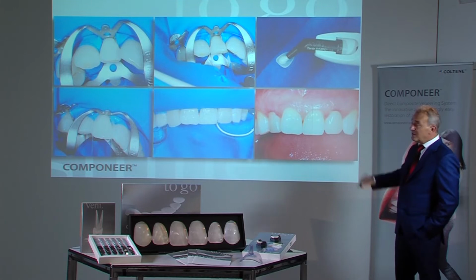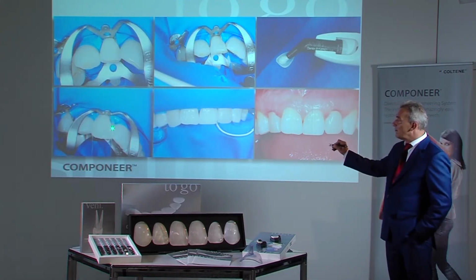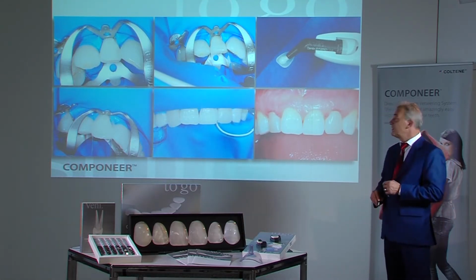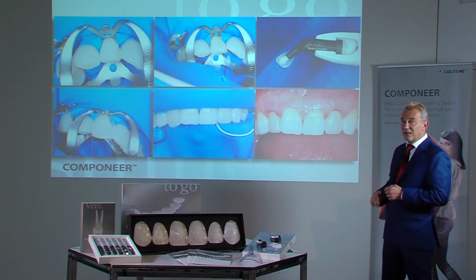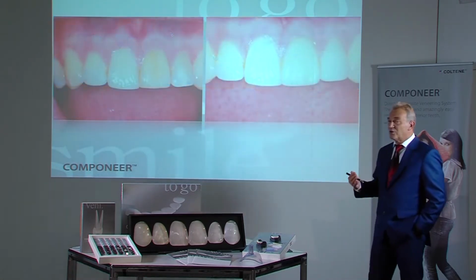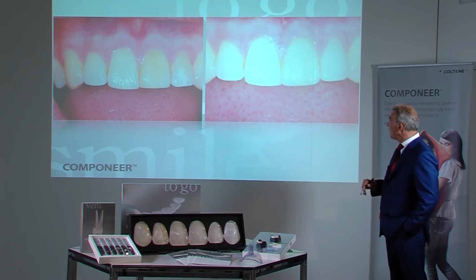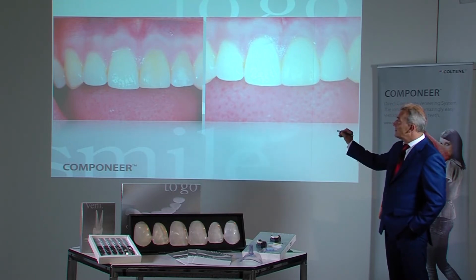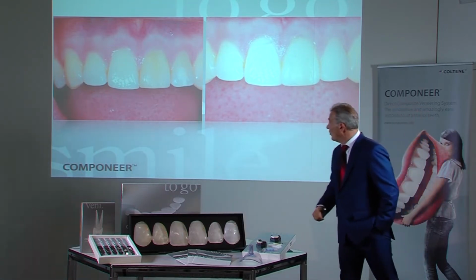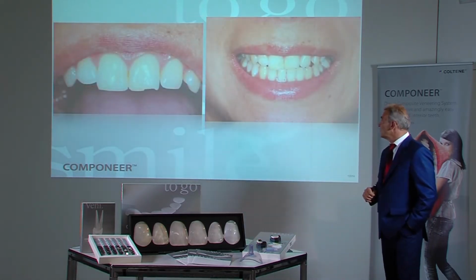As shown in the figure, dentine A1 and B1 was applied to give a homogeneous look, without the layer thickness in the background leading to increased translucency. The layer thickness plays a major role in single tooth restorations. Also in this example, we can see the discolored tooth of the single tooth restoration on the left, and on the right the Componeer was placed directly with dentine on the yellow surface.